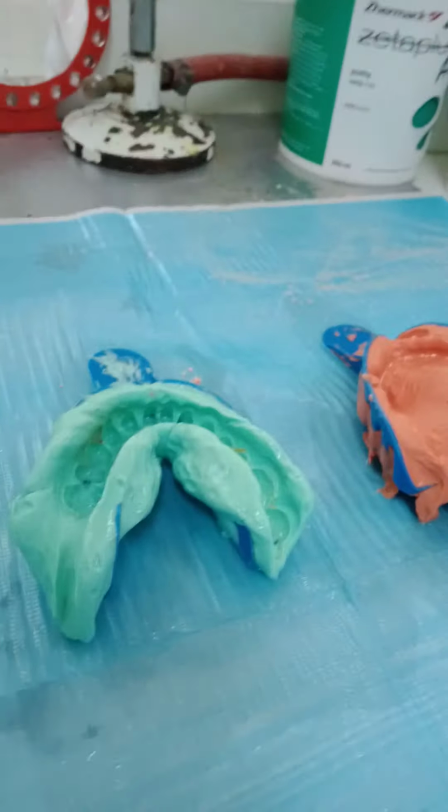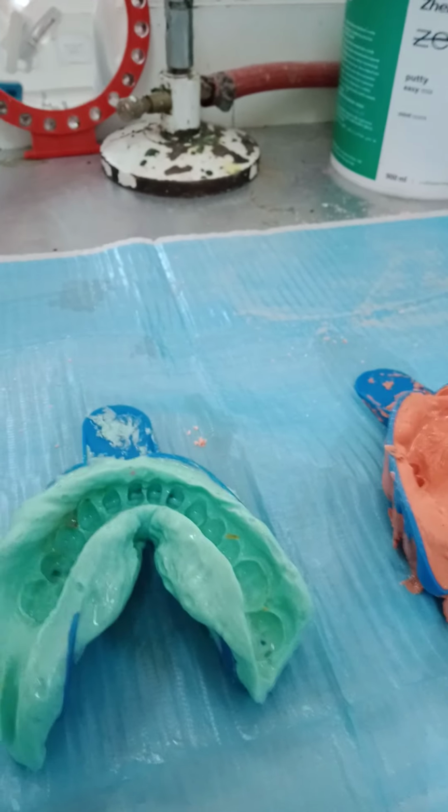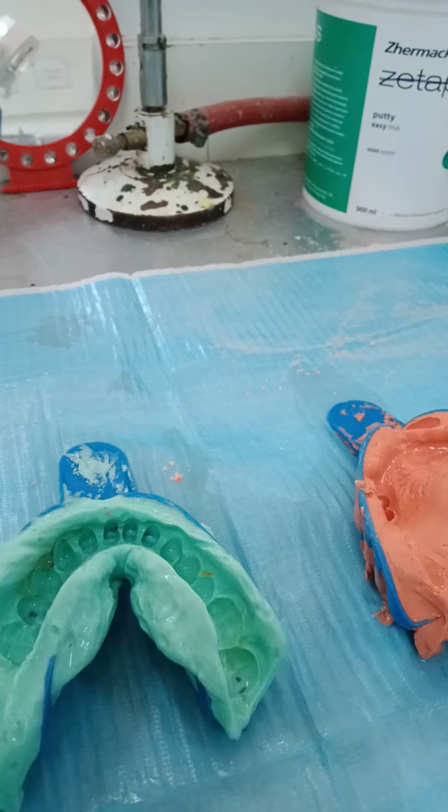Why did you take the lower? For recording the lower teeth. I need a lower cast. Do I need to take all of the sulci in it? No. I need only the teeth.